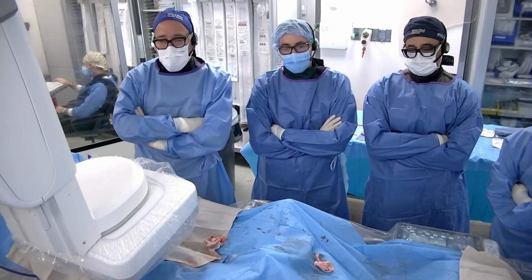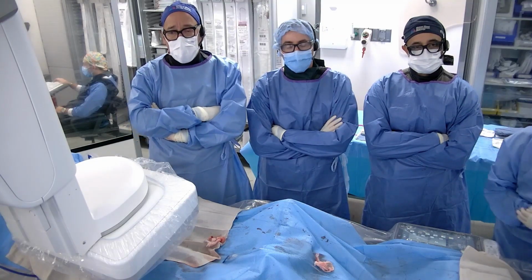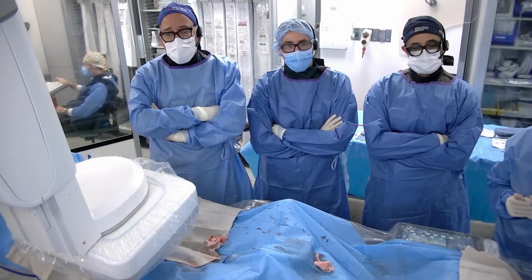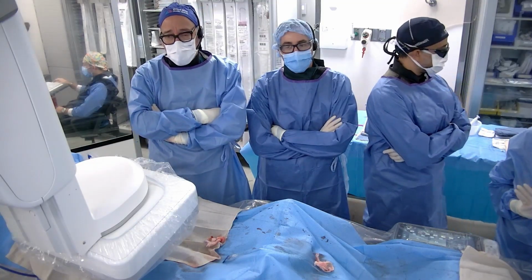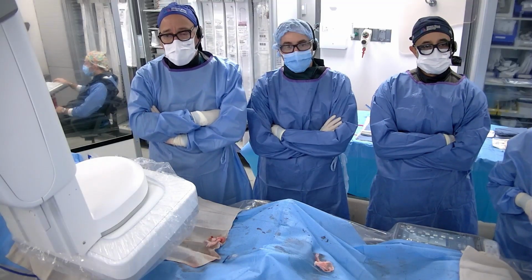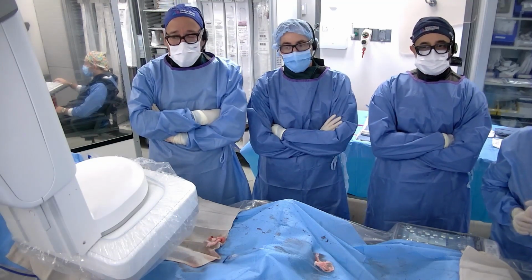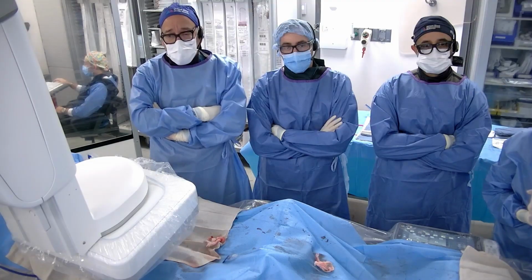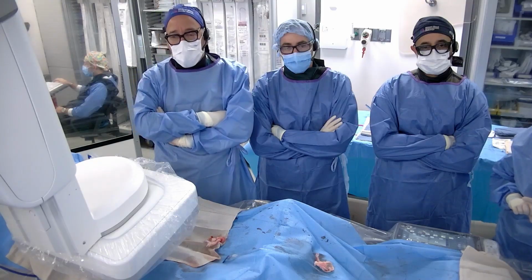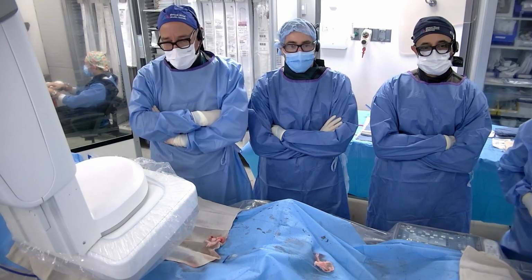Yeah, I think what I'm hearing is that we're probably going to send down an aspiration system, run it throughout the posterior tibial, possibly into the origin of the peroneal, and then up through the SFA and popliteal. We're probably going to end up drug coating ballooning with a 018 system, probably Ranger, for the entire length of the SFA. If I had to guess, we're going to end up putting in a scaffold at the origin of the SFA. And again, just the way that ostium of the TP trunk looked, I'm guessing we're going to put in something there also. And I want to go back and look at it after the aspiration with the IVUS.